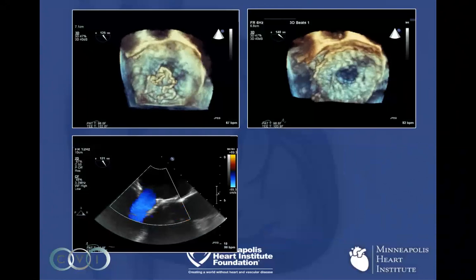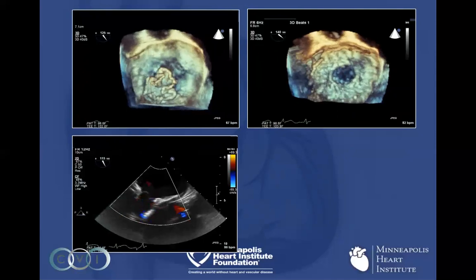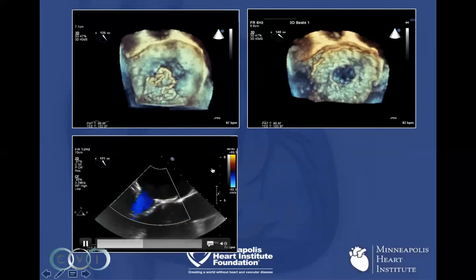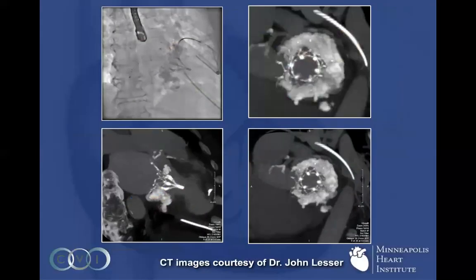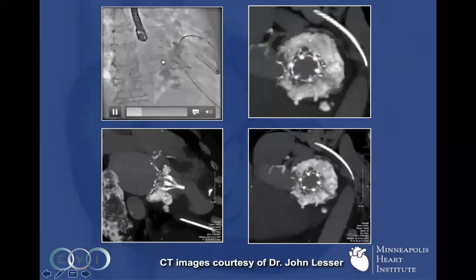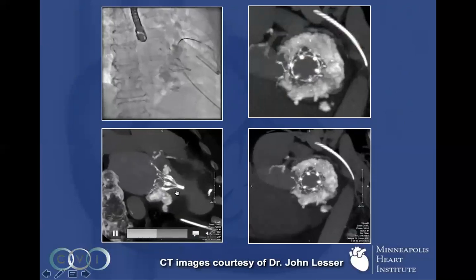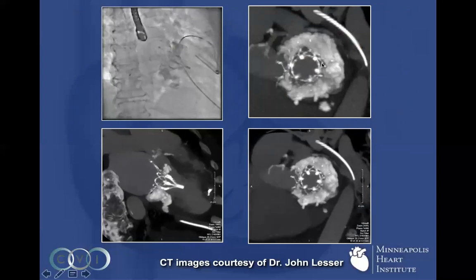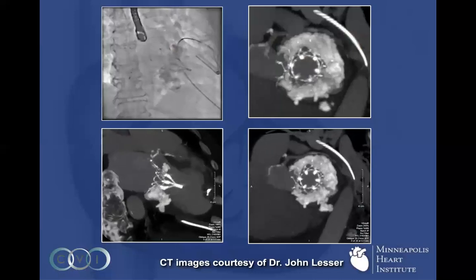Here's how the Tendine valve deployment is done. The Tendine valve — shown here in the top left 3D view, coming towards you with the aorta on top — is opened up slowly and deployed intra-annularly. As you can see in the lower left-hand side, the MR is completely eliminated. In the top right-hand side, this is a full deployment of the Tendine prosthesis. Here's an example of what it looks like in place: the Tendine valve inside that area of severe MAC. We close the atrial septal area with an occluder device. The prosthesis forms quite well, moves with the MAC, and doesn't displace it because it's intra-annular. Because we mobilized that spicule, the inner working of the mitral valve prosthesis is nice and round — leading to elimination of MR without mitral stenosis.